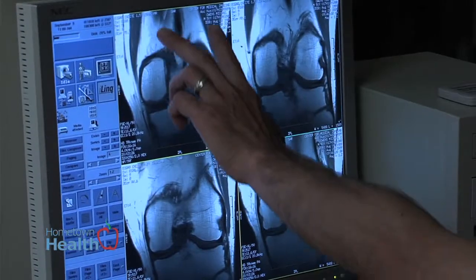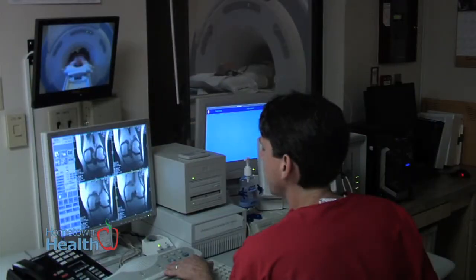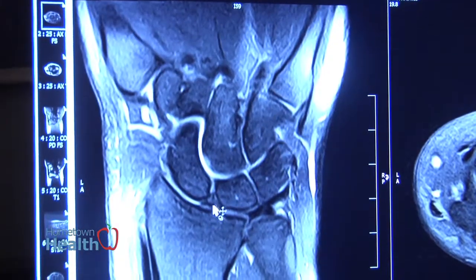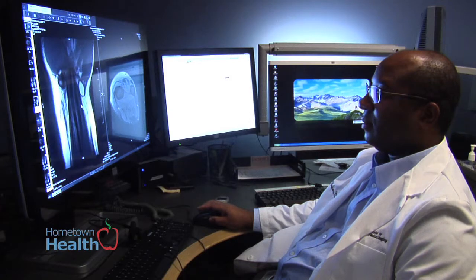Patients who, at the time of initial diagnosis and presentation to imaging, have marked synovitis as revealed by marked thickening, those patients also tend to have erosions at an earlier stage. The implication is that MRI potentially may play a role in helping to stratify patients into those who may have more aggressive disease processes. And therefore that information may be useful to the clinician to try and decide what kind of therapies to institute.